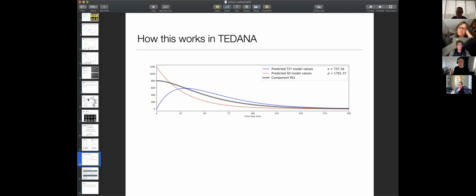Okay, so why not stop there? It seems like, once you have the ICs, the independent components, why not just use them? Why this funny thresholding and so on? I think because they wanted to be able to output time series that people could then put into other analyses. Yeah, that's why.